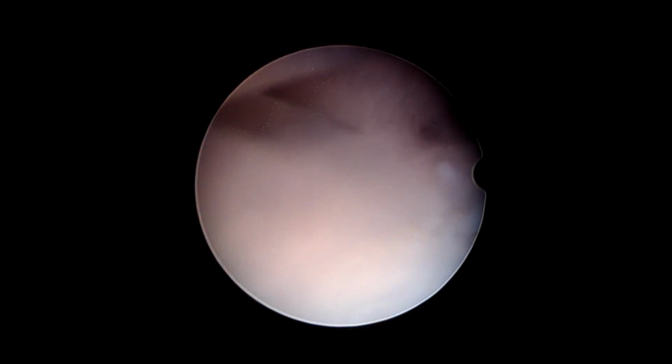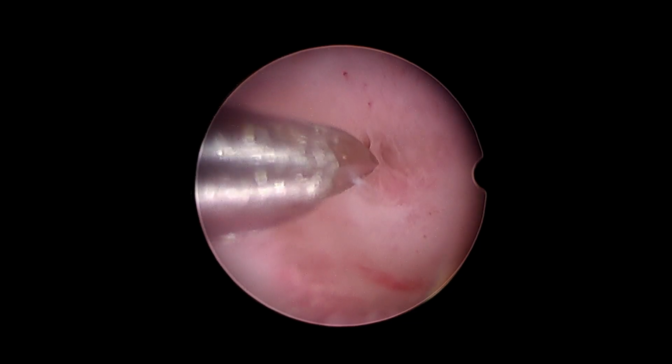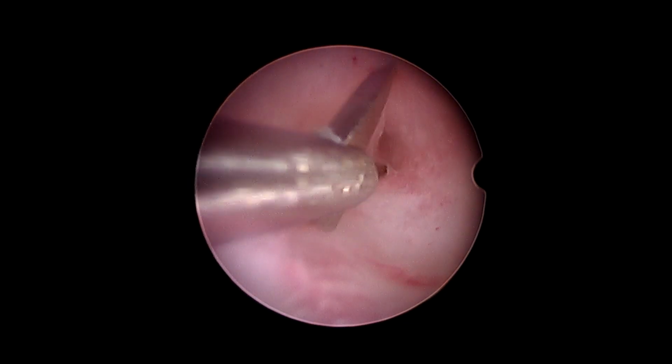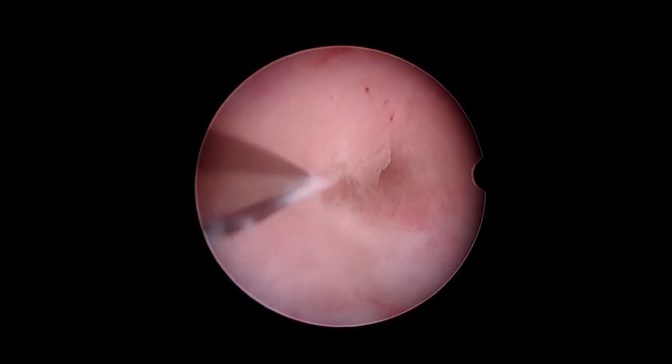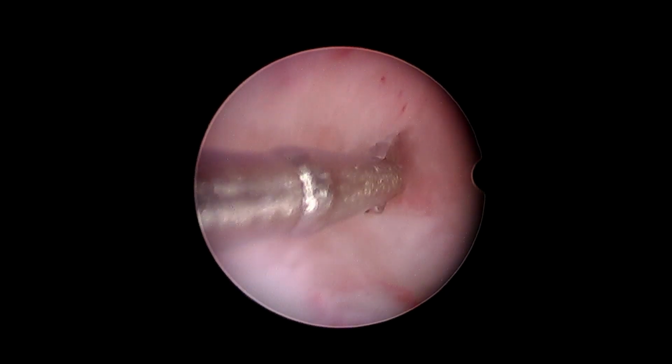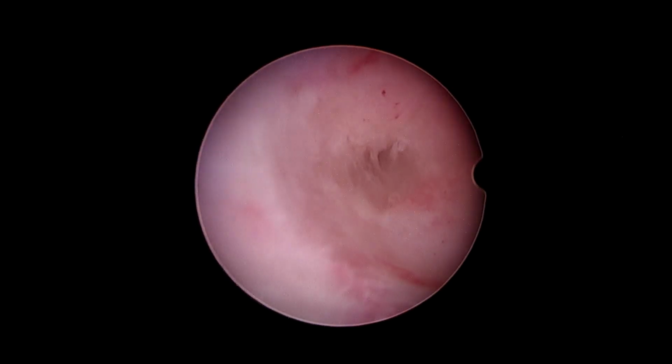And if you cut through the scar, there is a high possibility that after excision of the scar, the endometrium is going to proliferate over it, and you will have good healing, and you can minimize the recurrence of intrauterine adhesions.